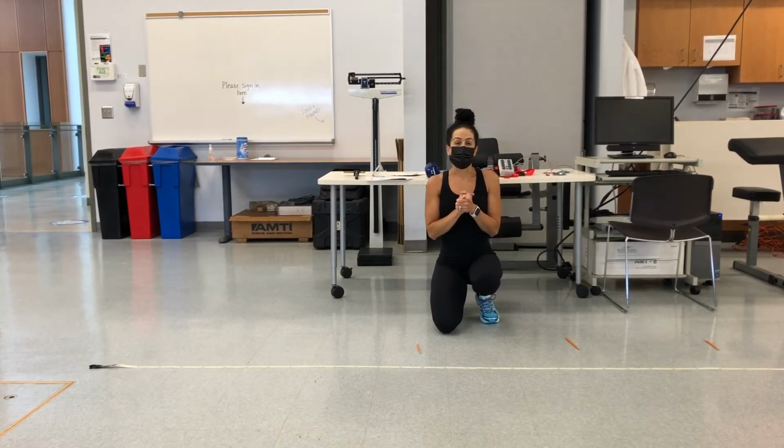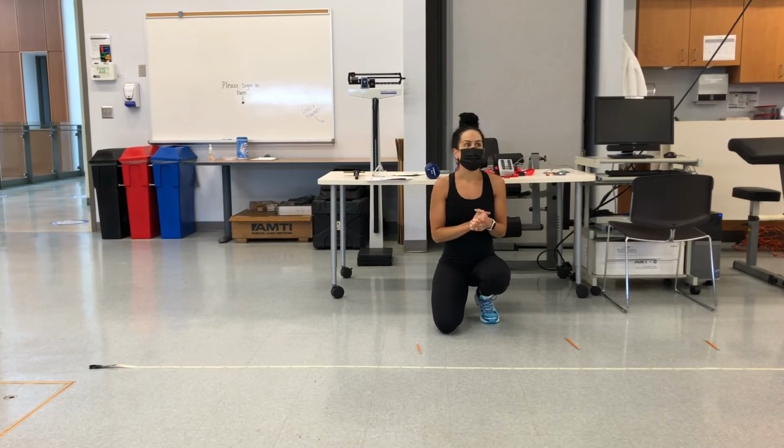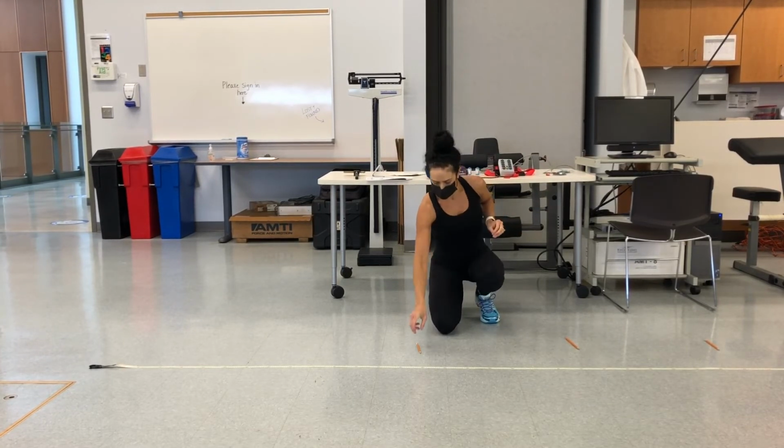Something else that you always want to think about with this lab is step back for a second. Does this make sense? So if you are getting a step time of 1.5 seconds, that is not correct. If you are getting a horizontal velocity of 300 meters per second, also not correct. So always good to just take a step back.